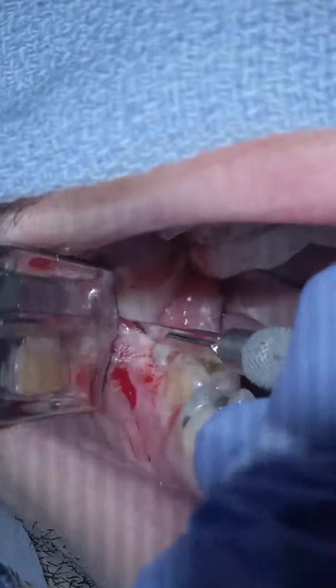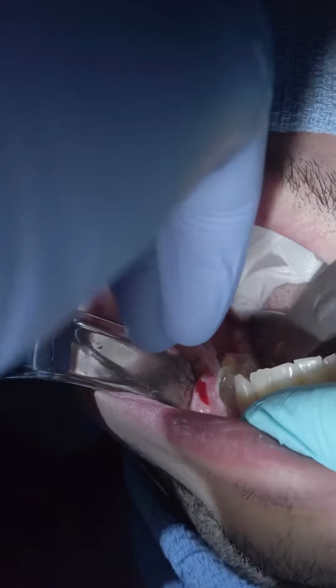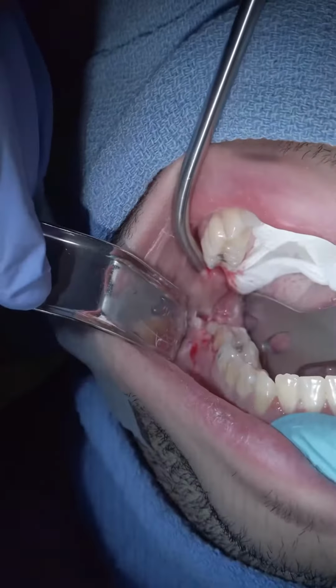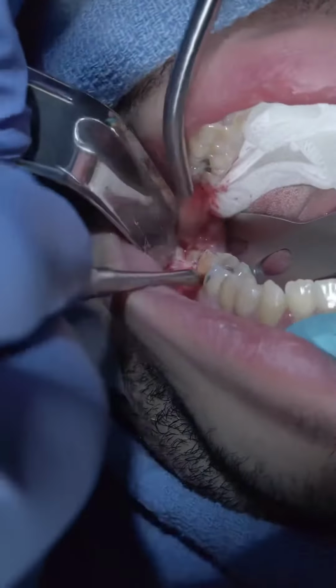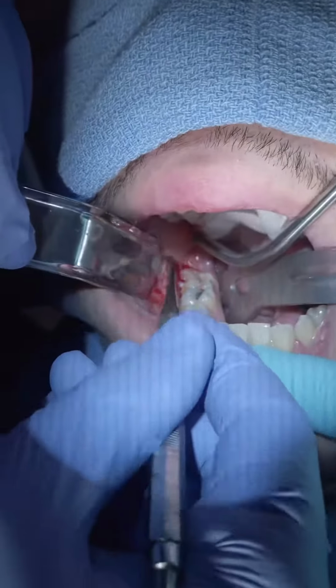Now this is a little bit different because that tooth is doing a little peekaboo action right here, so we're going to have to really go around that sucker. Then what I like to do is go right into the sulcus in the front and behind that papilla, just like that. We're not going to reflect that papilla unless we have to. We're going to do our full thickness mucoperiosteal flap.